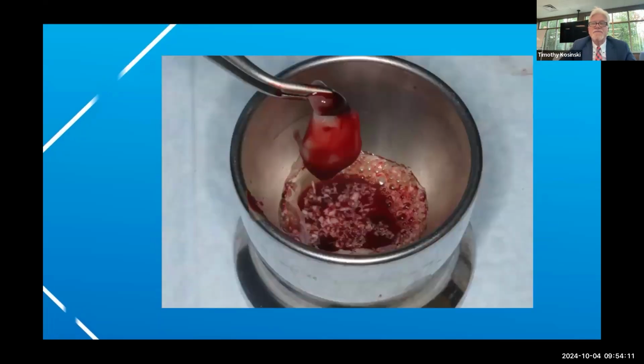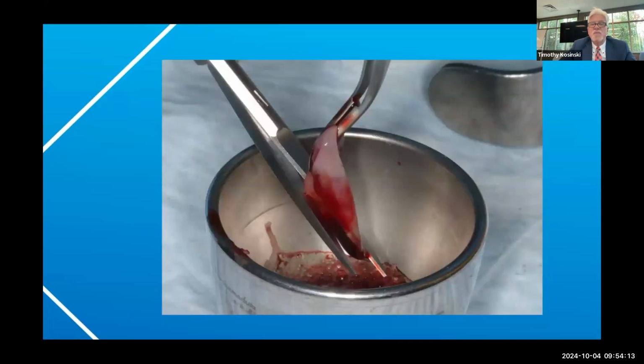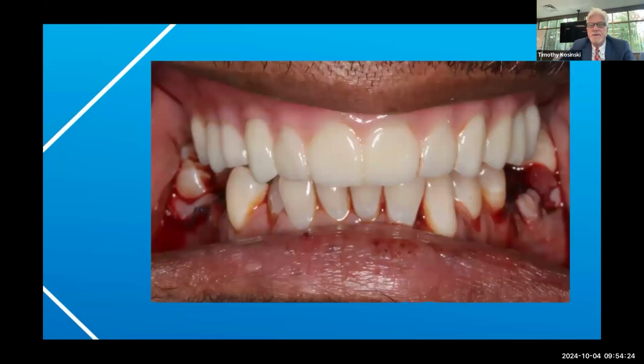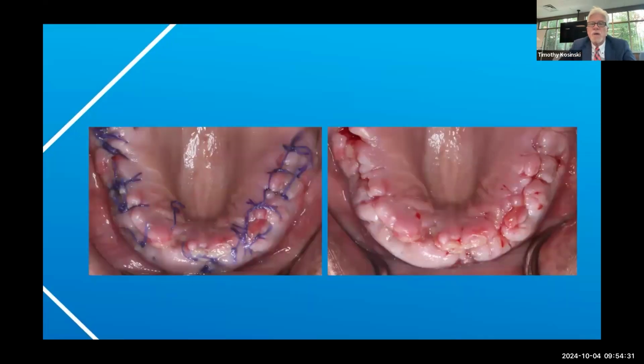I then grafted with our Newport biologic graft. I cut it in pieces, made sticky bone, used the remaining PRF as my membrane, sutured the site, seated a denture, which fit perfectly because it's all digitally designed preoperatively. One week post-op with PRF. It's just amazing, amazing healing.